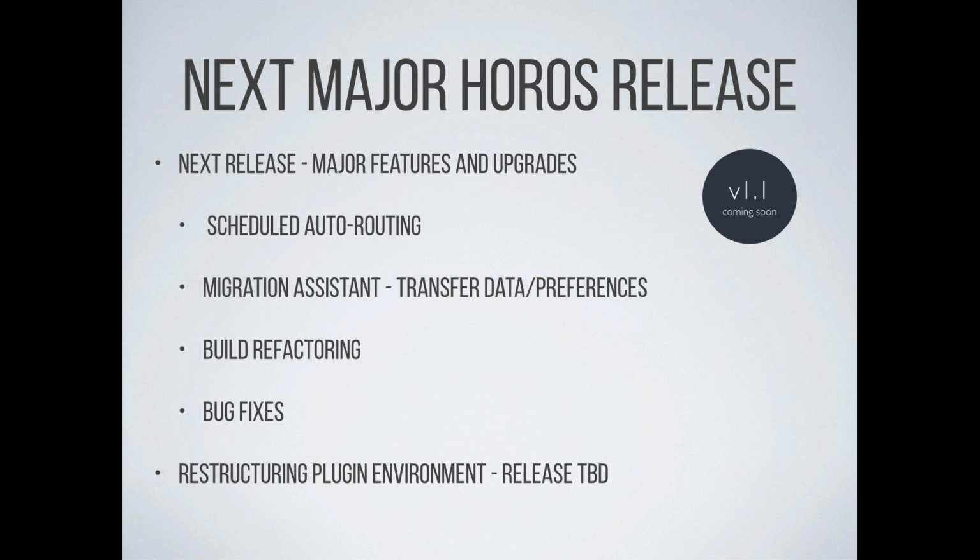If you need an archive, there are lots of wonderful resources, both open source and paid for applications to address image archive needs. And Purview has some wonderful cloud-based image management products to use alongside Horos to archive your medical images long-term. And I would encourage you to engage with Horos and investigate what options are there if you need to archive medical images permanently. But Horos is a wonderful medical image viewer, and it is also an incredible 3D workstation and can certainly retain a couple thousand imaging studies in its local database very easily.